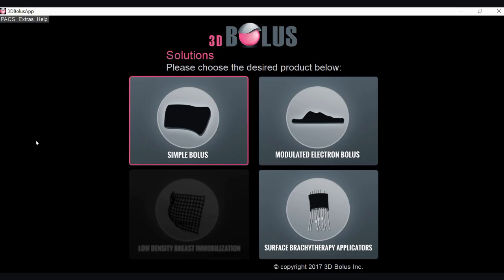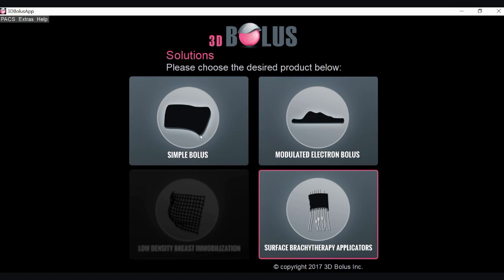Today we're going to be going through a demonstration of our software. Our 3D Bolus home screen shows the different modules available to users. To date we have developed a simple bolus module, a modulated electron bolus module, and a surface brachytherapy applicator module. Our software allows for new modules to be incorporated into our existing software interface and to follow roughly the same workflow for ease of use to our users.